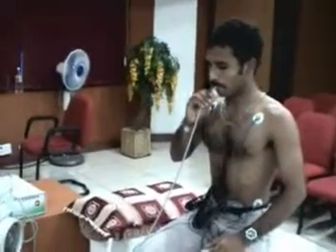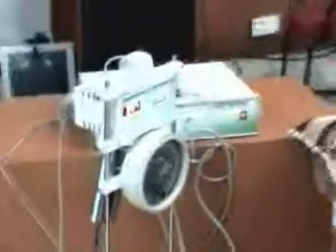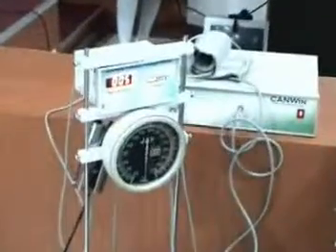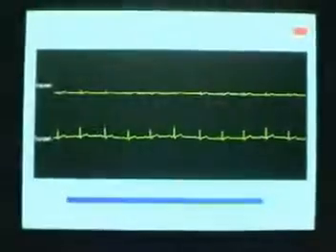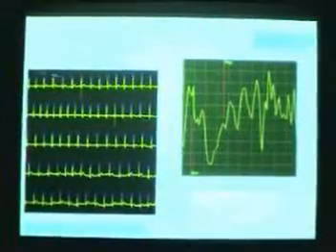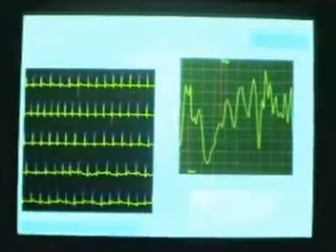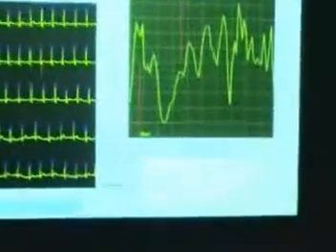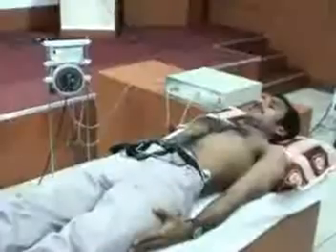Now the red light is on, and the patient blows through the tube, maintaining it at around 40. Now he is asked to take the tube away from his mouth. Now this is a display of the entire report during the Valsalva maneuver, and again you can see the average RR interval, the coefficient of variation, and the Valsalva ratio appearing to be within normal limits.